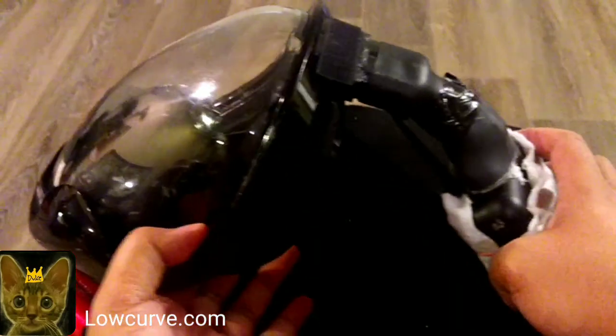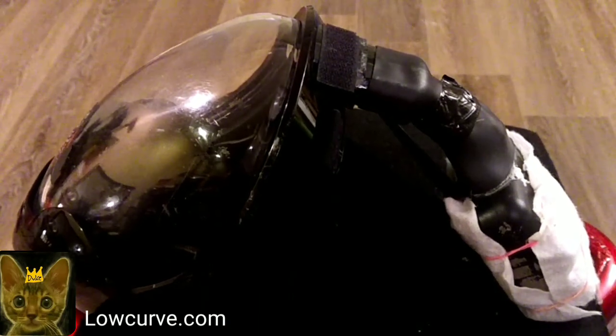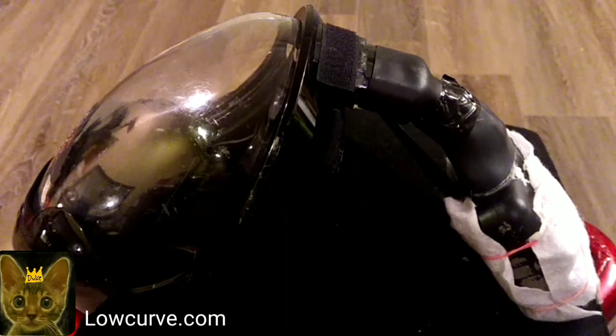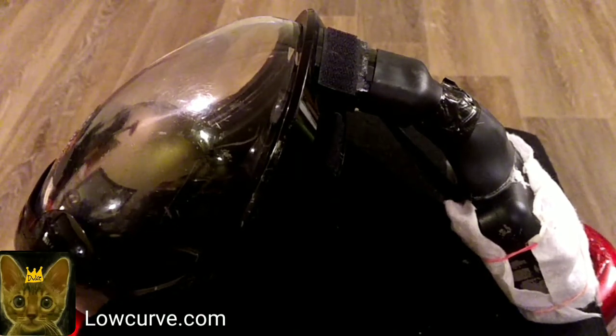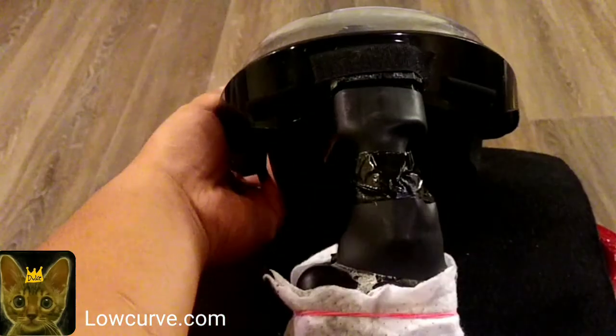The benefits of this, I probably wouldn't use it every day like I do with my regular Infinite N95, just because I have a decent lung capacity and I don't have any troubles breathing. But again, it's for people that might have trouble breathing through a filter material. And again, actually, let me address this.